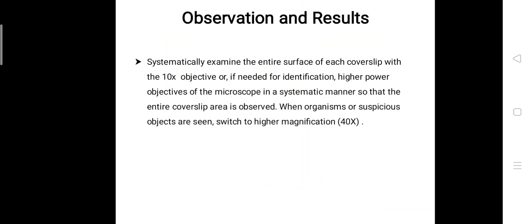For observation and results, systematically examine the entire surface of each cover slip with the 10x objective, or if needed for identification, high power objective of the microscope in a systematic manner so that the entire cover slip area is observed.